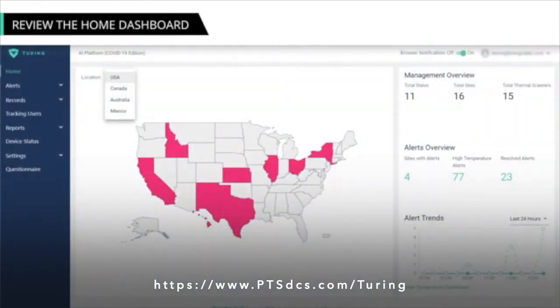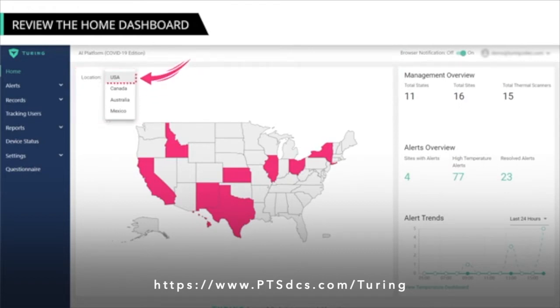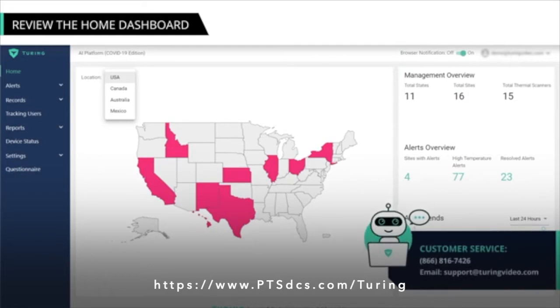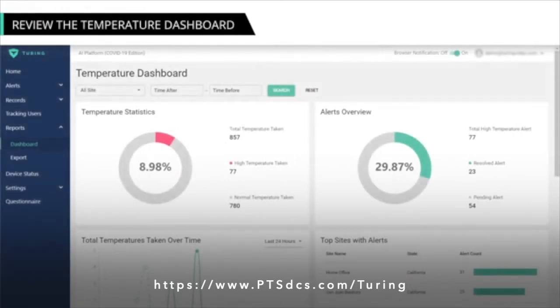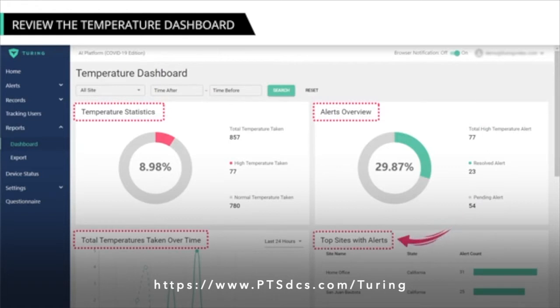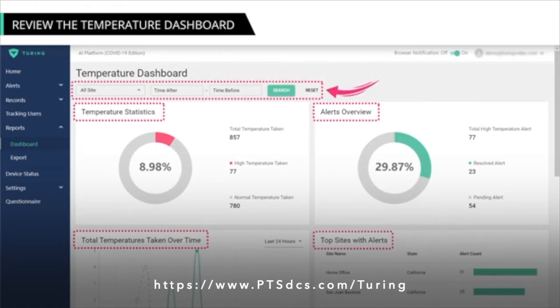One of the responsibilities you have as a system administrator is to monitor different data using the dashboard. The dashboard page shows device coverage for the USA, Canada, Australia, and Mexico. You can change these locations using the Location drop-down. If you are using the device in a country not listed, reach out to your internal Turing Video advocate or customer service at 866-816-7426 or email support at TuringVideo.com. You can go to the temperature dashboard page to get statistical views for all sites assigned to you, including temperature statistics, alerts overview, total temperatures taken over time, and top sites with alerts. You can also use the filters to view data for a specific site and time.